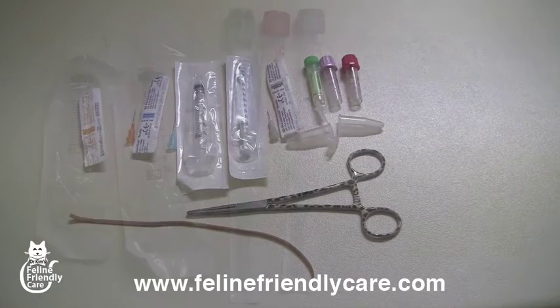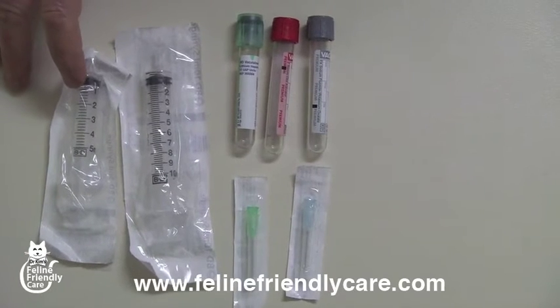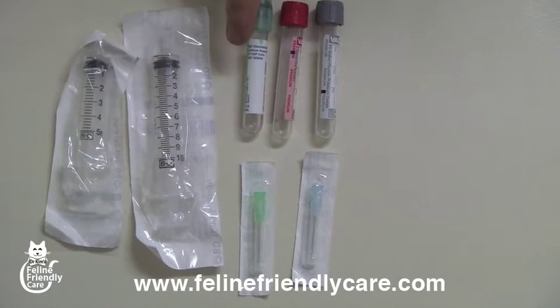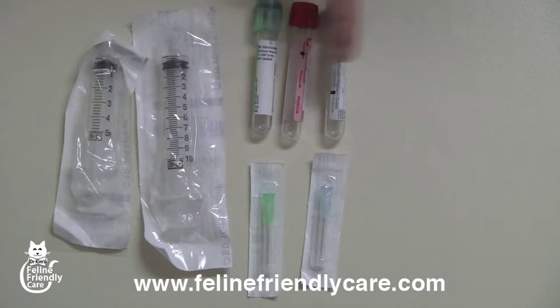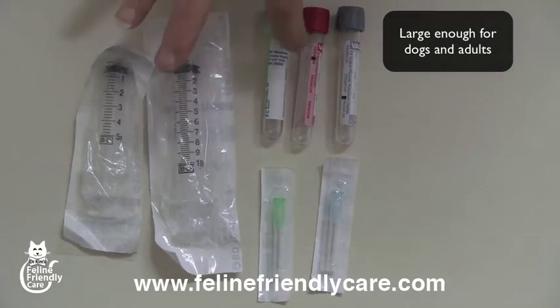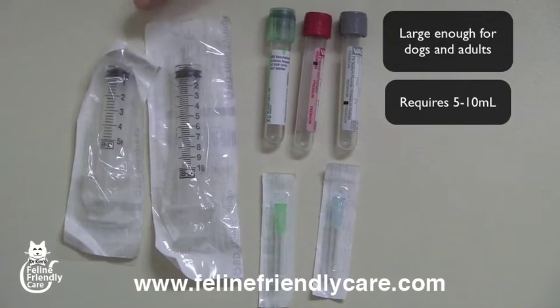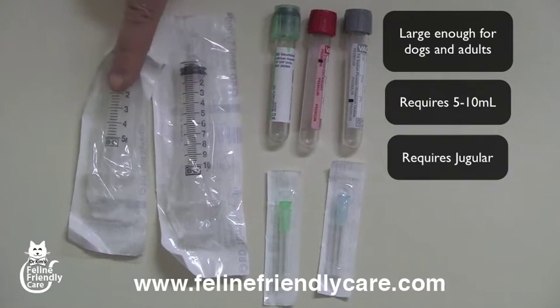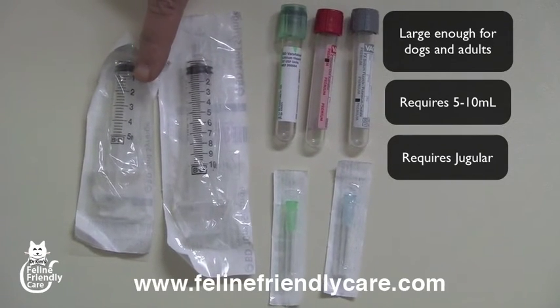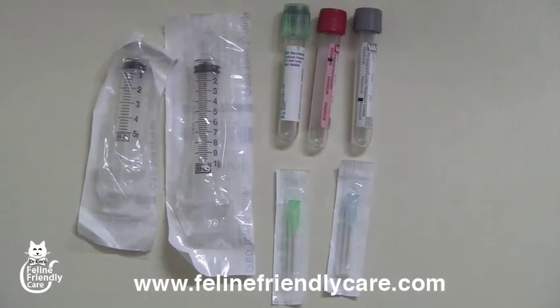This is the equipment that you would commonly be expected to use to get blood out of a cat's jugular vein in order to do tests, and that's because the laboratory supplies office will give you these tubes, which are human-sized tubes and dog tubes, and that means that you have to get at least 5 to 10 milliliters of blood out of a cat, which means you do have to go into the jugular, particularly if you're using these big syringes. There's a lot of vacuum pressure on it, and that will collapse a cat's cephalic vein, but you can get blood out of the jugular. You need the longer needles as well, and you need 2 people holding the cat in order to do that.